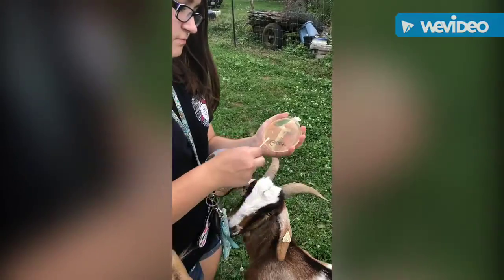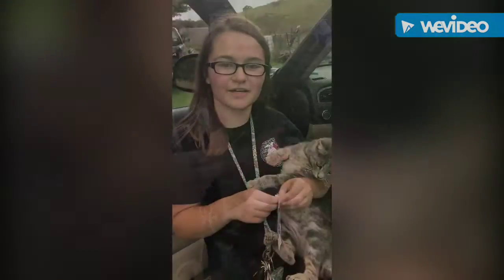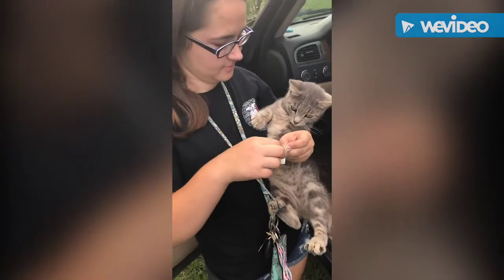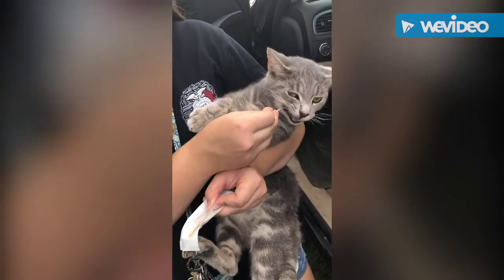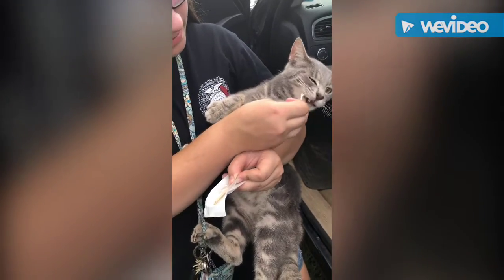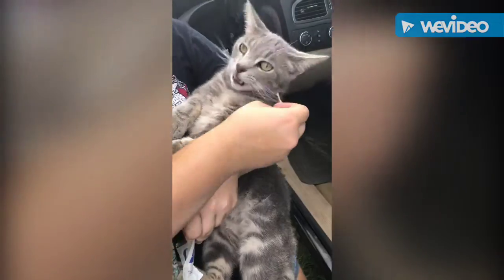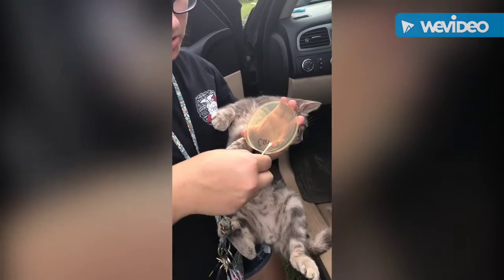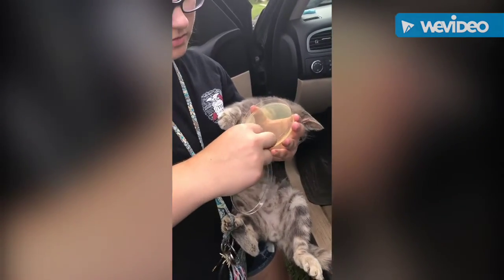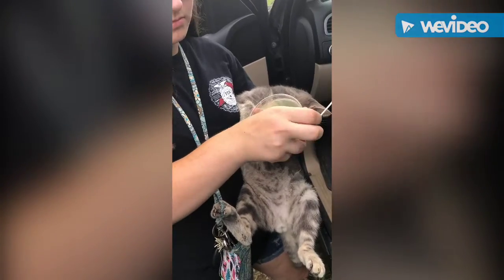Alrighty. Swabbing my cat. He's not too thrilled. Come on, good boy. Good boy. Come here. Get some more. Sorry. Gently rubbing it on. There we go.